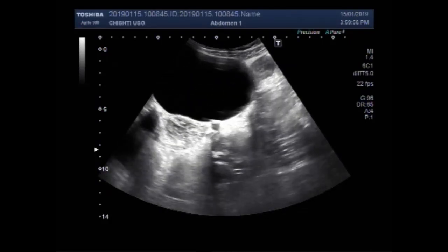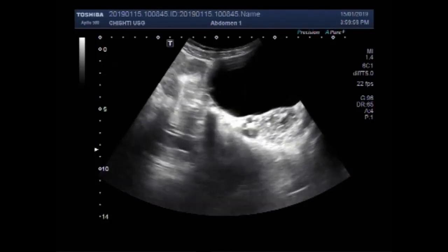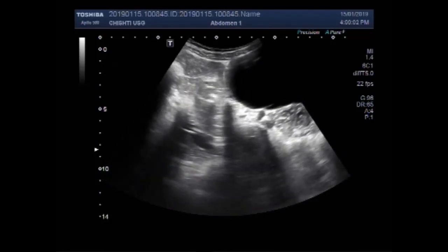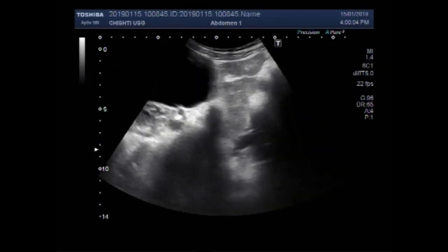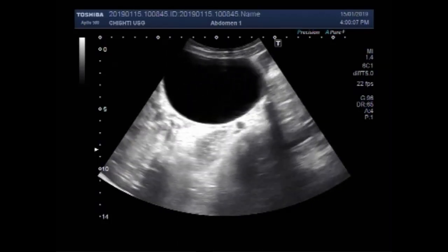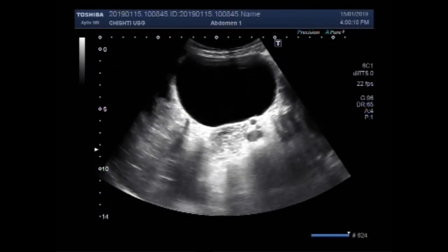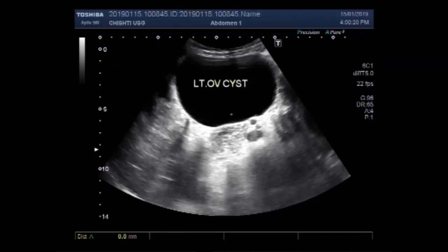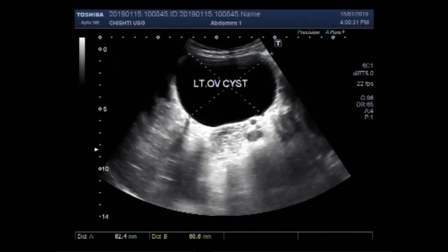This is the ovarian cyst. This is the large ovarian cyst, and this cyst measures about 8.2 cm into 8.1 cm — quite a large ovarian cyst.